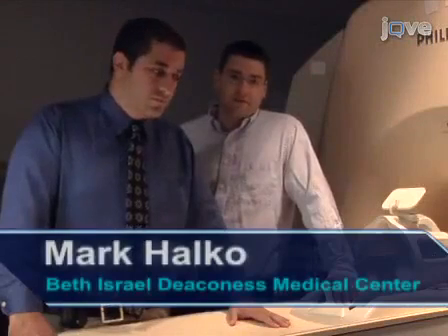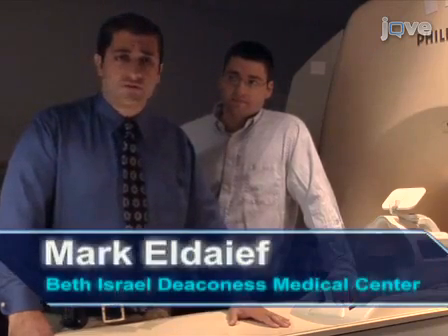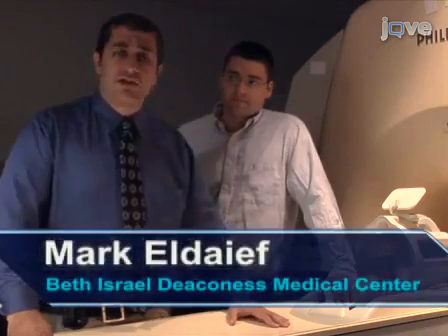The main advantage of this technique over fMRI alone is that with TMS we can modulate one area to observe network dynamics. This method can help to answer key questions in the field of cognitive neuroscience — not only can it better elucidate interactions within a given resting network such as the default network, it can also help us to better understand interactions between the default network and other resting state networks.